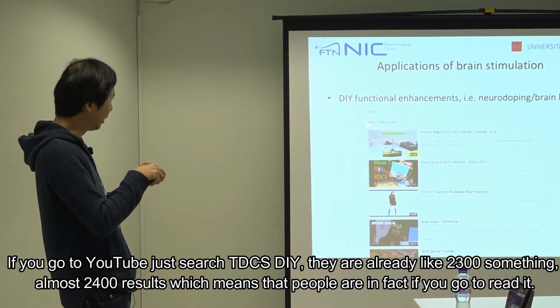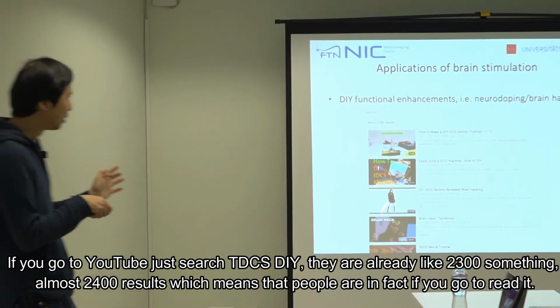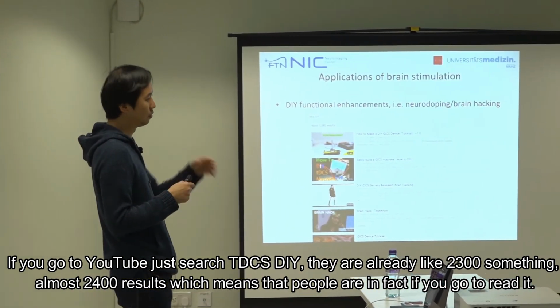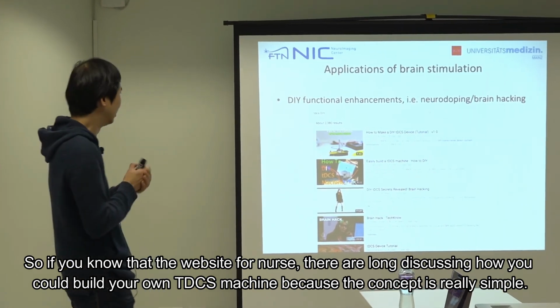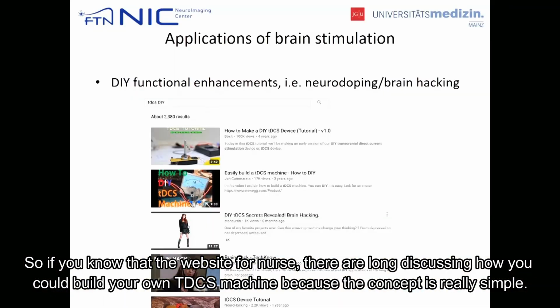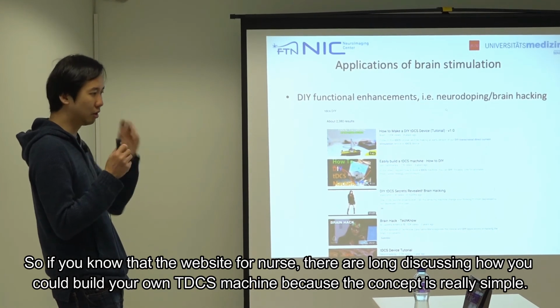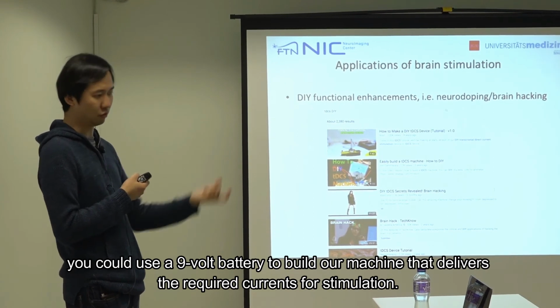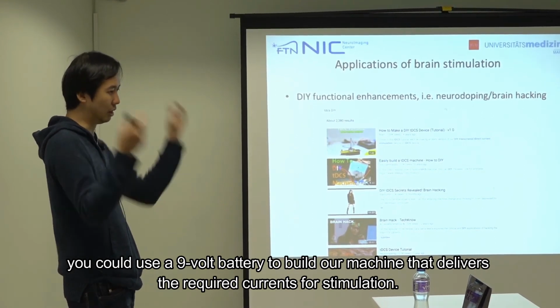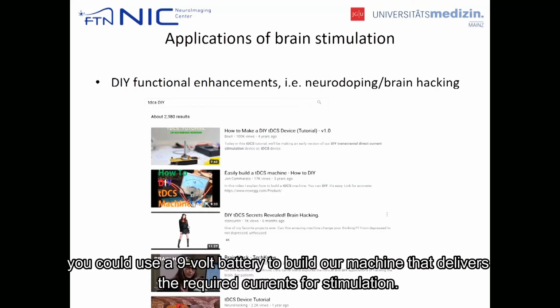There are already like 2,300, almost 2,400 results, which means that people are doing it. If you go to Reddit, the website for nerds, there is a long thread discussing how you could build your own TDCS machine, because the concept is really simple. You could use even a 9-volt battery to build a machine that delivers the required current for stimulation.